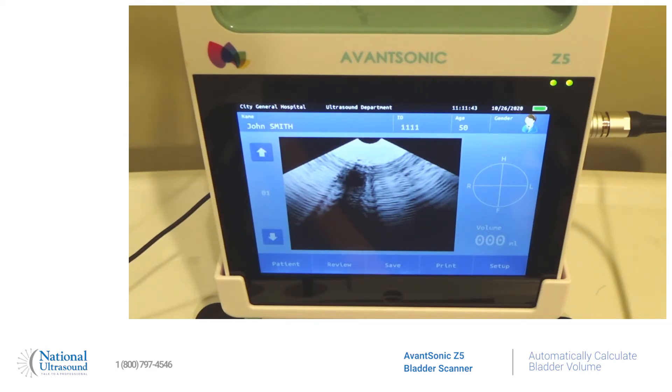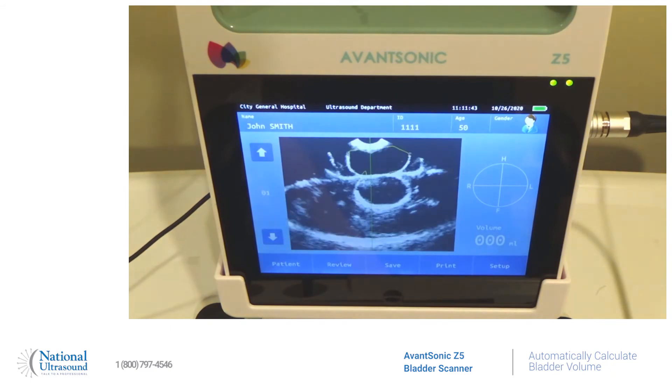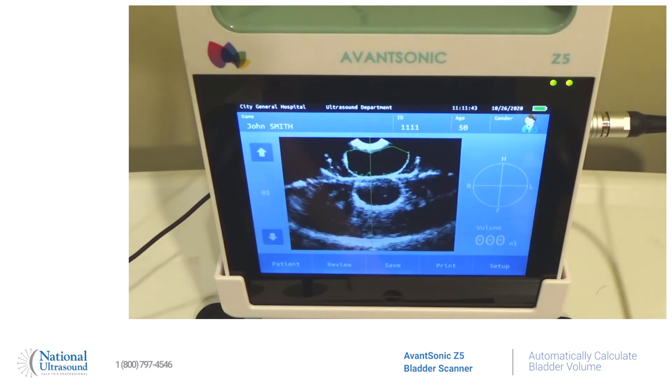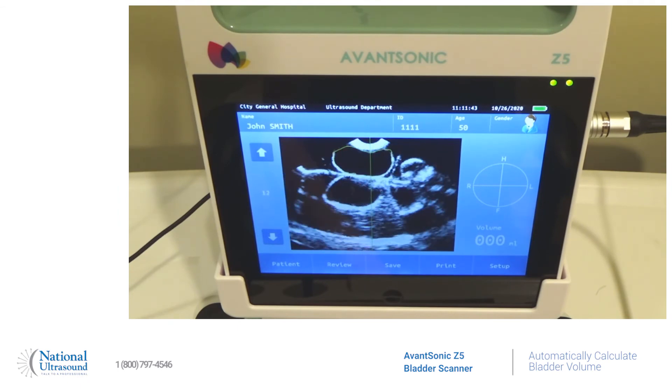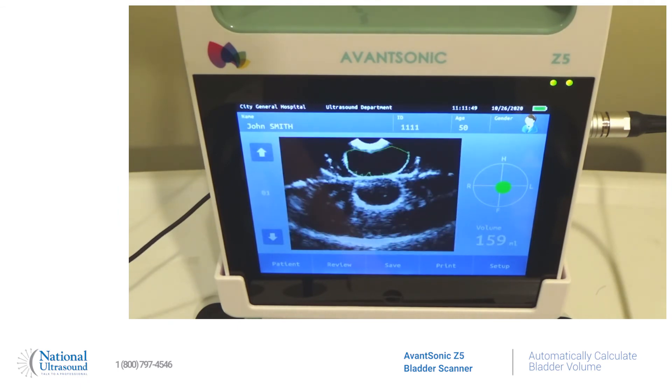I'm going to press the button on the probe and we're going to find our bladder. Once it's located nicely, it'll have a circling green around it. You're going to press the button on the probe again and it's going to do a sweep and scan through, then it's automatically going to calculate our bladder volume — you can see it on the right-hand side of the screen here at 159 milliliters.